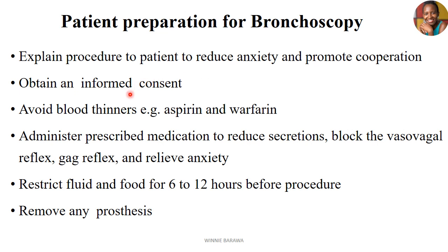Then obtain an informed consent from this client. Let them sign the procedure consent form that they have agreed to the procedure and any related outcomes, and how they can come in case of further management that is required.